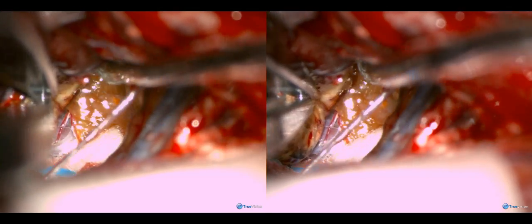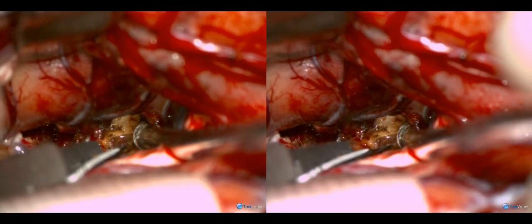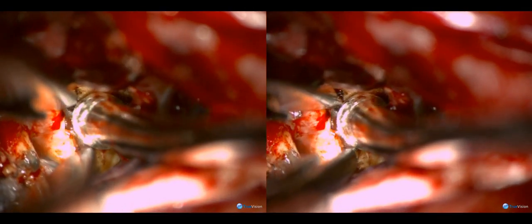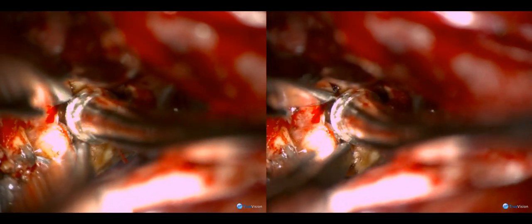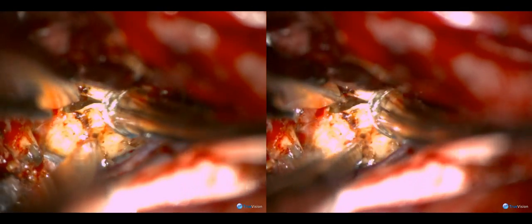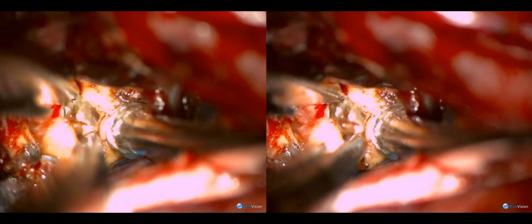You can see a pocket of old blood that here is being entered and evacuated. By entering these pockets and evacuating their contents, the mass of the lesion is debulked. This slackens the malformation and allows it to be more mobile.